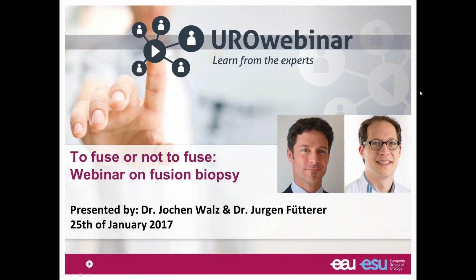And what about, for example, how many MR courses do you attend for interpretation of MRI of the prostate? And we should perhaps also think about certification. But those are, I think, very important questions. And if you have a 1.5T system, which is high quality, I think that's already enough to do a high quality prostate MRI.